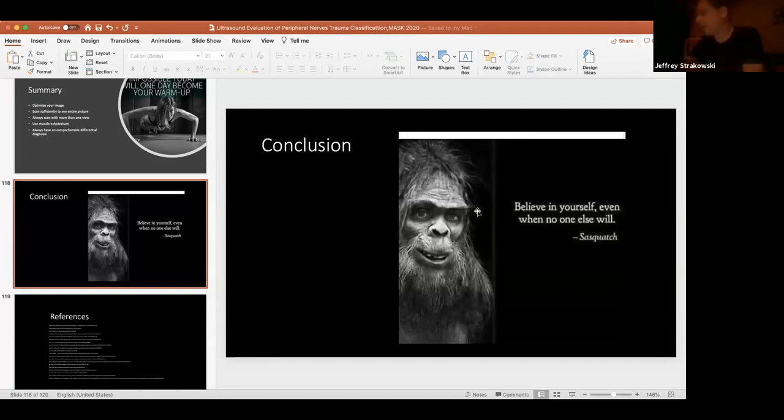Well, it's kind of the higher frequency for very superficial structures, the more detail that you see. It's a great question. What I found is, though, virtually everything I can see on the Vivo, I can go back to the conventional ultrasound and see it also. But by using the Vivo, I think it's more just ingrained me to look for some of these things that maybe I wasn't looking for before. And it kind of tunes you in. Some of these conventional instruments keep getting better and better. You don't necessarily need that level of detail all the time. Sometimes it's maybe more than you need. But for teaching purposes, it kind of clues you in on things that you can look for. Like you saw that fibular nerve, you can see all that detail and all those different fascicles once you learn to start looking for them, because they're the same in most people and they have the same pattern.